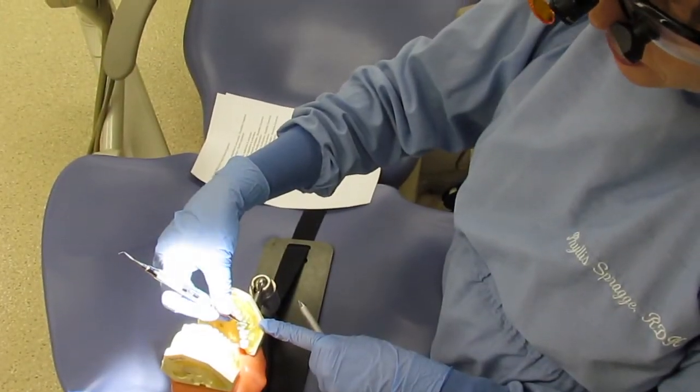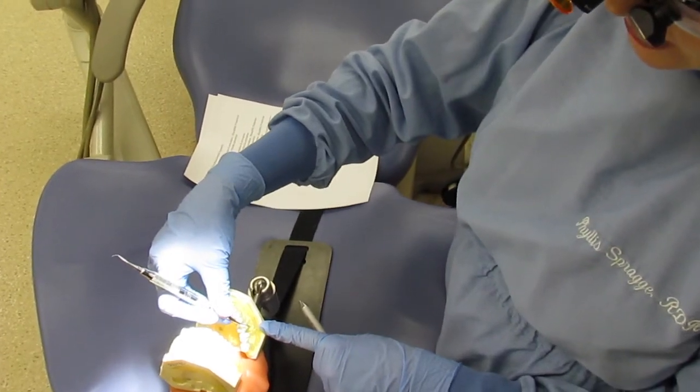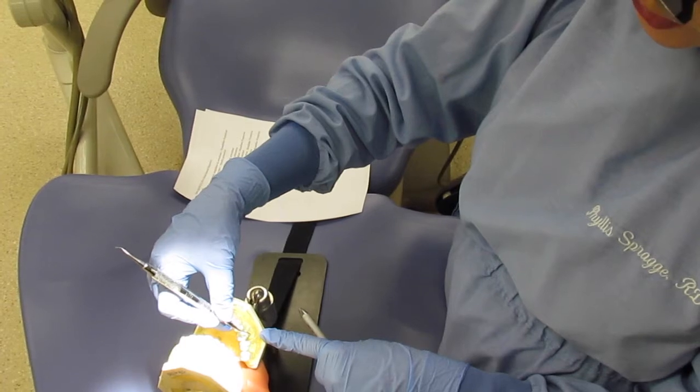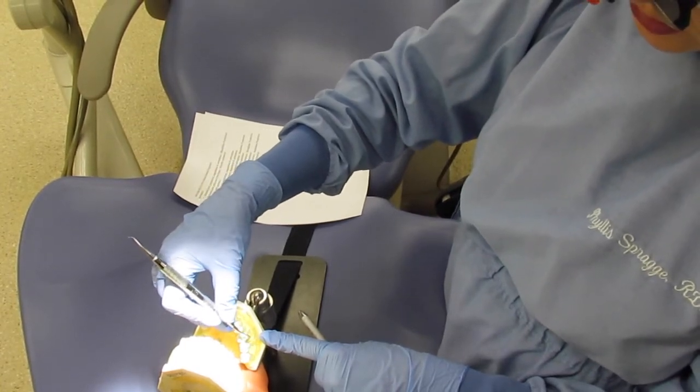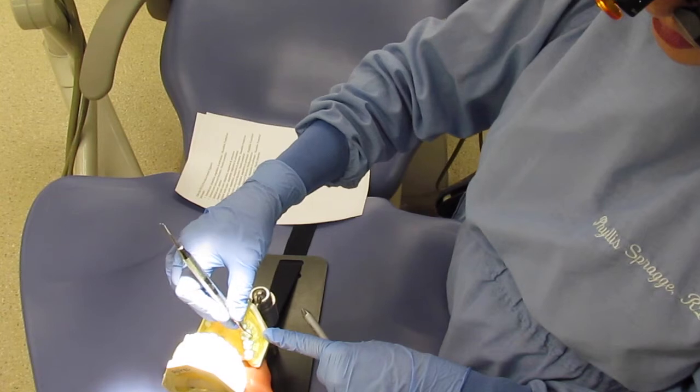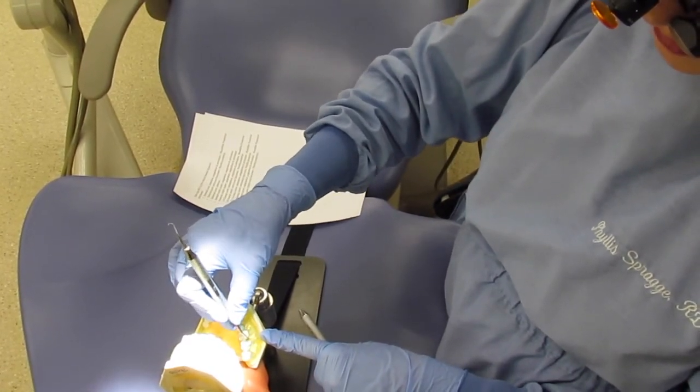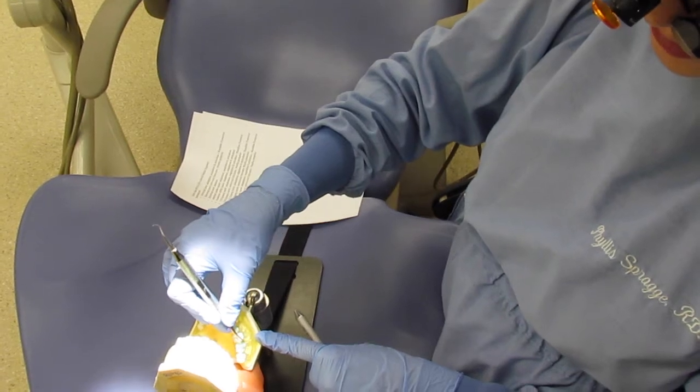Universal curette on the distal surface. Your fulcrum is across the left side anteriors and your toe is pointing toward the distal. You're on your secondary blade and you're rocking up and down, little overlapping strokes and pivoting into the distal area.